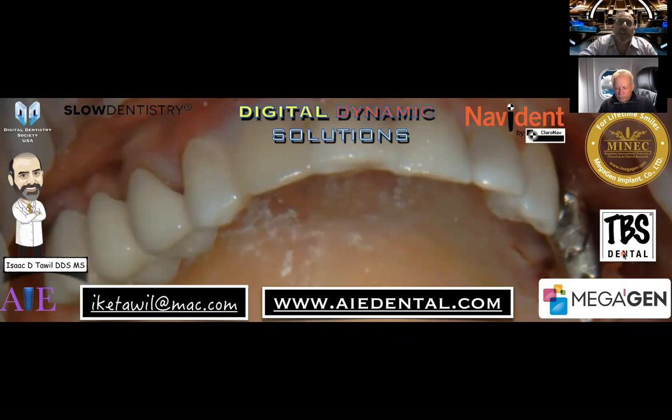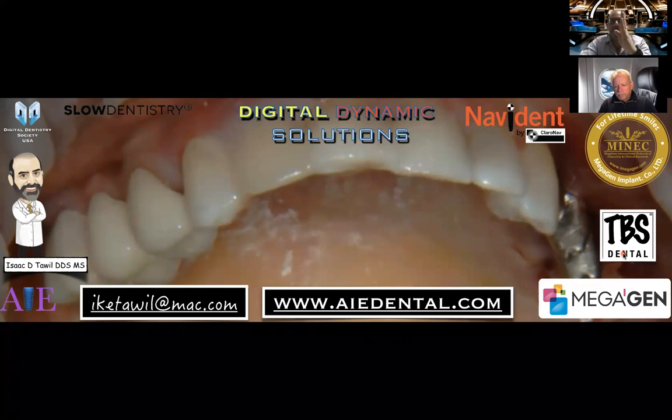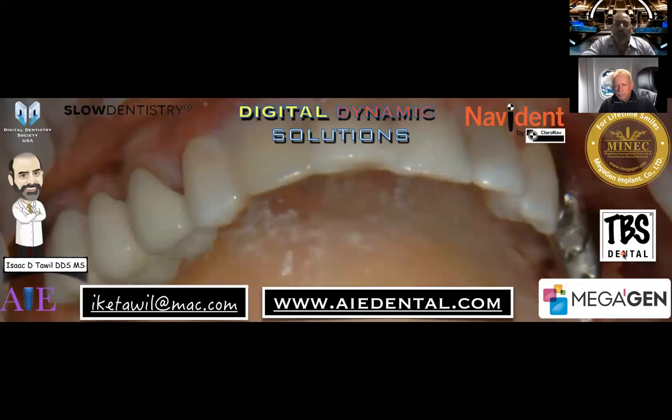If it's, let's say, a lateral incisor that's curving towards the canine, I now will be able to cut out that root towards the curve, where the apex of the curve is. And now I have a nice amount of non-disrupted bone where I can place my implant in a perfectly straightened out parallel position. So when I see those curved roots, I immediately think maybe immediate loading, because of the fact that I'm going to have a lot of undisturbed bone that hasn't been drilled for an osteotomy. So removing the contents is quite easy with dynamic navigation or guided navigation. Without it, it is a little bit tricky.